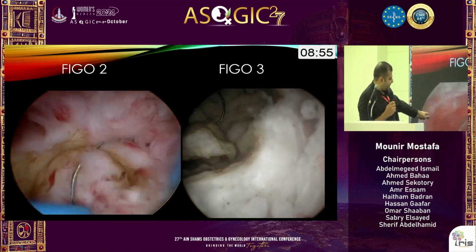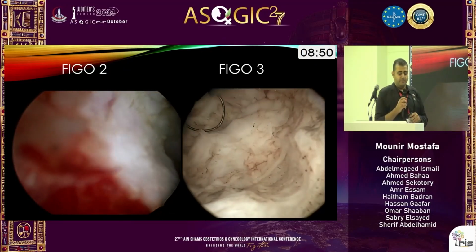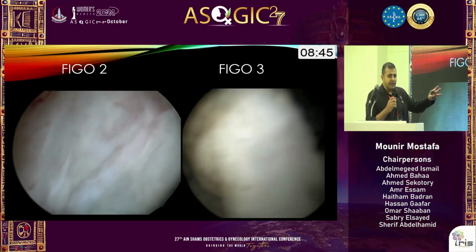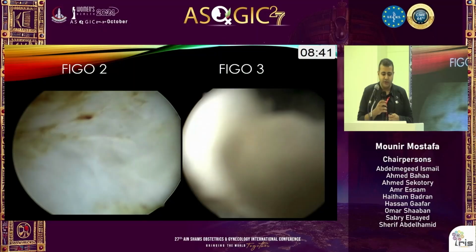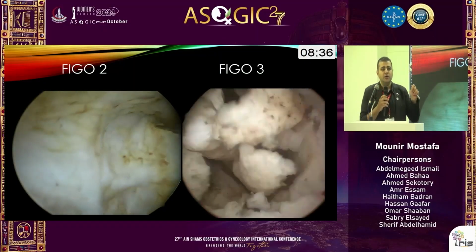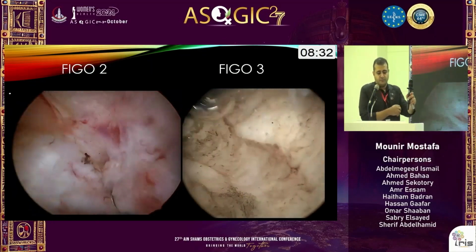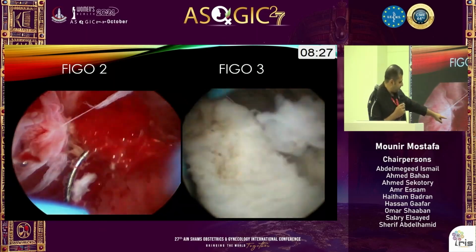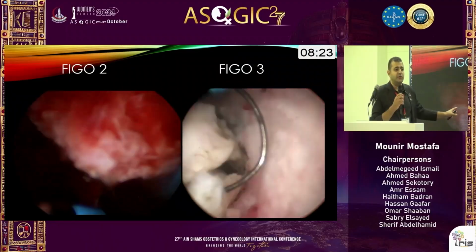This one, we finished. This became like an empty myoma. We are trying to push it, make it a degraded myoma. Now, when we use the evacuation with the open forceps, you will see the pseudocapsule with no traces of resection. Okay. This is after evacuation. This is the pseudocapsule of the myoma. We don't have any injury there.